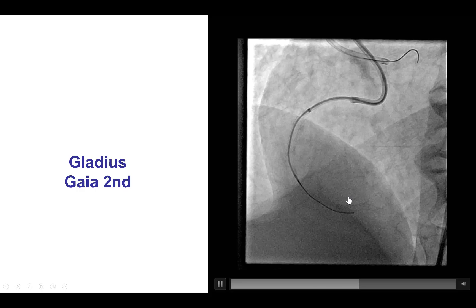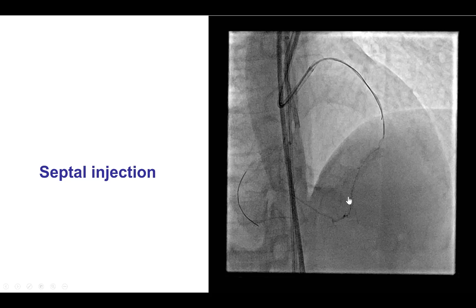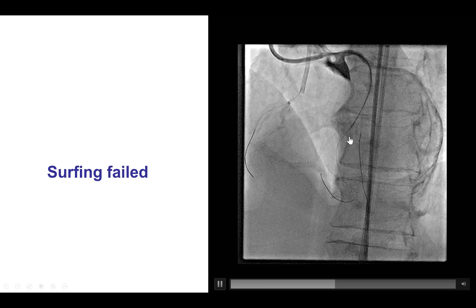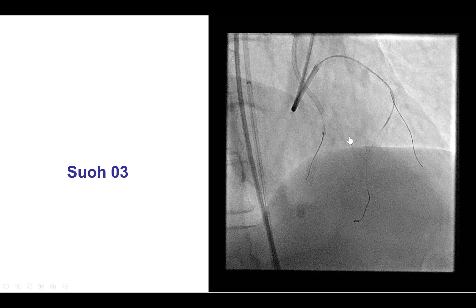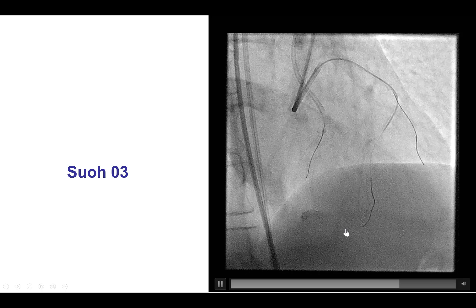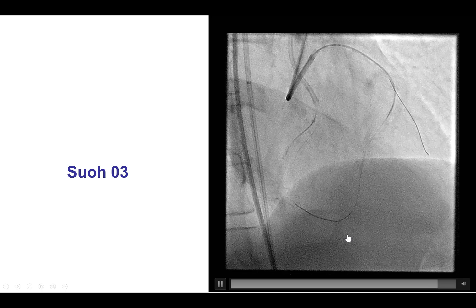We therefore changed to retrograde crossing. We were able to engage the first septal, did an injection, and there was significant tortuosity. Surfing was not successful, and then we tried with the SUO-03 guide wire, which is a very soft tip guide wire. It had some difficulty but eventually successfully crossed from the septal all the way into the posterior descending artery. This wire requires patience — it's very soft, but sometimes it takes a little time to cross the septal.